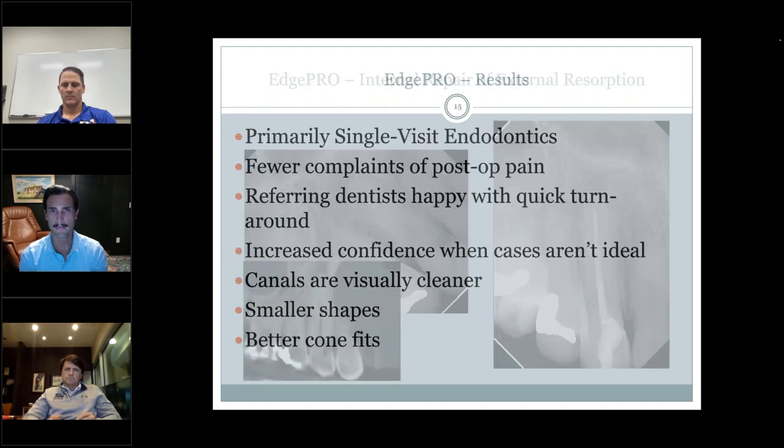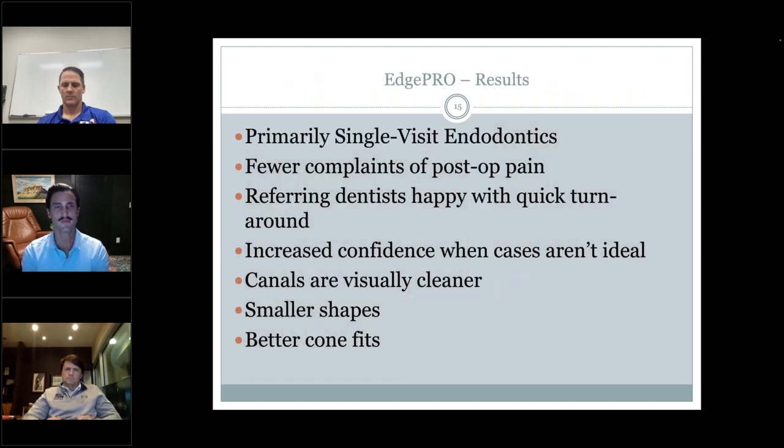And so some of the results, and I've touched on some of these throughout my presentation: I was always primarily single visit, but there were cases like sinus tracts and large lesions and C-shaped canals and difficulty with maybe the apical 1 or 2 millimeters with getting patency, or maybe ledges or transportation of the original canal down towards the end, just the little challenges that we face as endodontists doing tough cases.